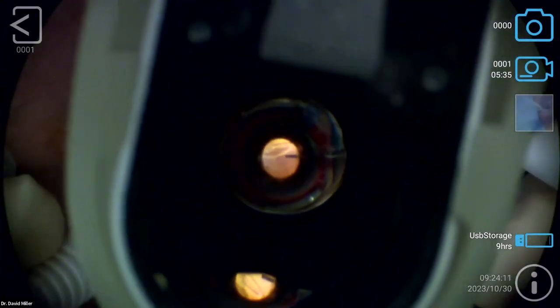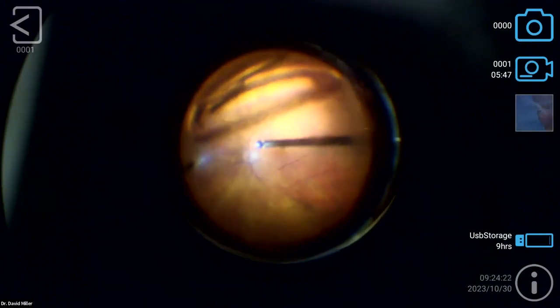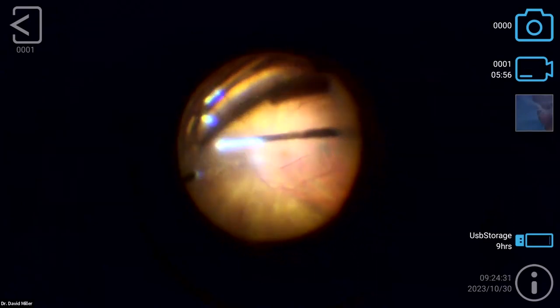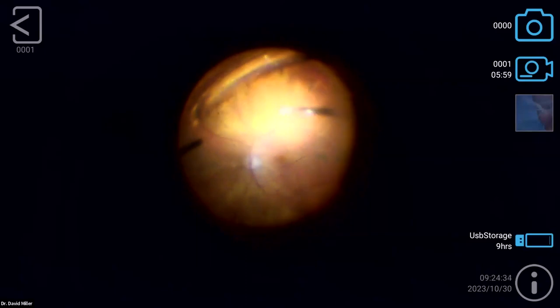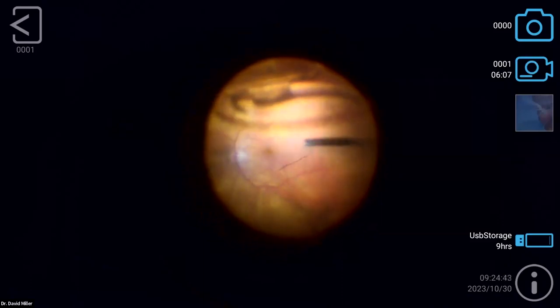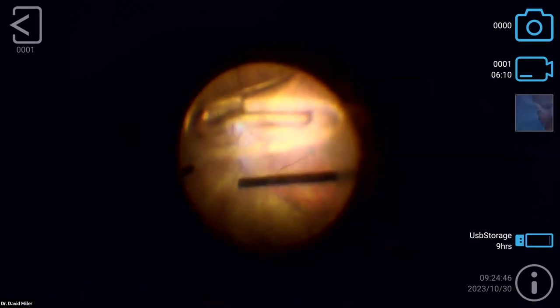Okay, we're going to start our vitrectomy here using a Leica microscope with a wide field visualization system, DORC vitrectomy setup in EVA. And we're going to do the vitrectomy first. So things to get in trouble with are pulling out these lens implants when they're wrapped in vitreous and the retina can tear. Then, of course, you get a detachment right then or a few days later, very disappointing. So if we can get the vitreous out of the eye, and you can see that lens implant moving because it's entangled in that vitreous. So we want to get the vitreous out first so that we can do this surgery safely.